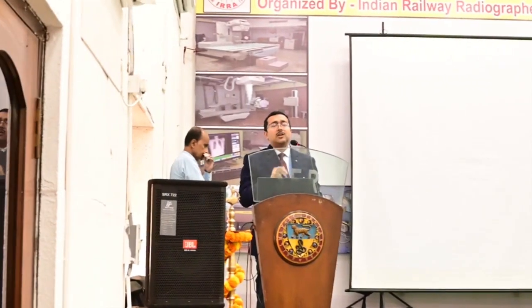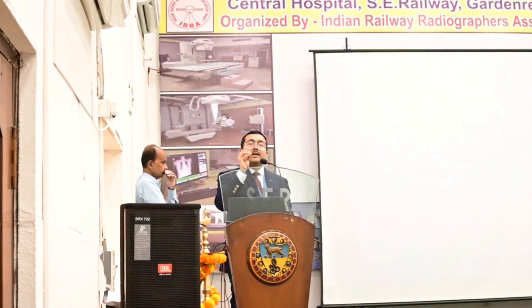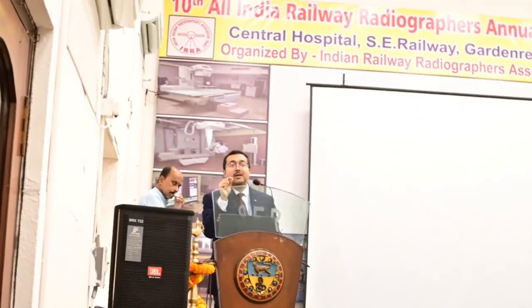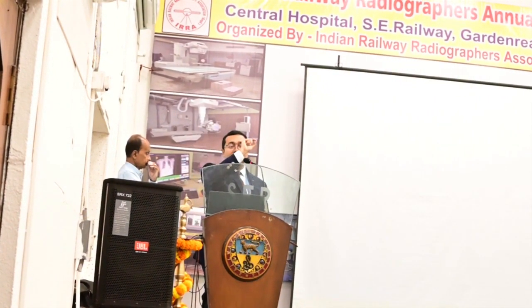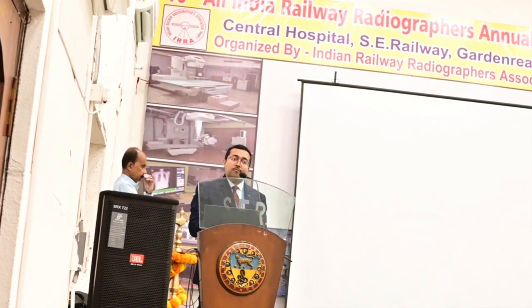This is actually an aseptic generation of the gas. We see it as a very common finding in day-to-day practice of advanced degenerative changes. It is postulated that due to the degeneration, there is some aseptic gas production in between the two vertebrae, and gas will appear as a dark line in your X-ray. If you see a strip of air within the intervertebral disc, that is known as the vacuum phenomenon.